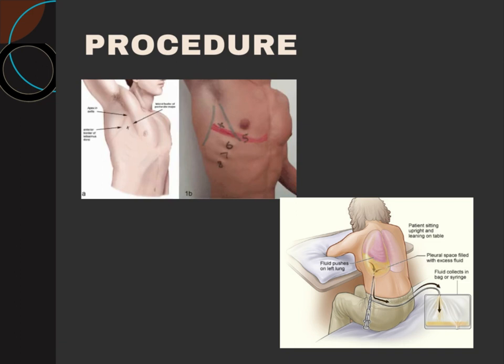But in terms of pleural effusion, if you are thinking of inserting a drain for any fluid, then you need to do ultrasound to mark the point of insertion. It's not always the safety triangle because fluids are normally collected at the bases, and you need to look at the fluid collection. Maximum fluid collection is on the posterior aspect or on the lateral aspect, where the major depth will be and what should be the point of insertion, and it should be ultrasound guided.